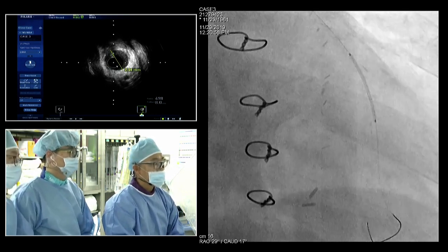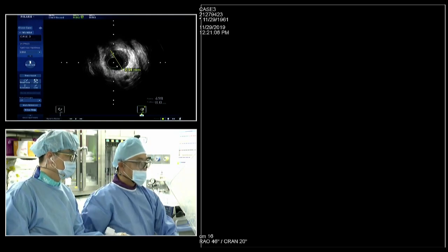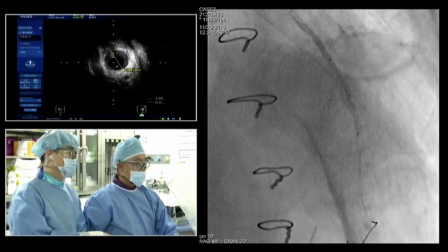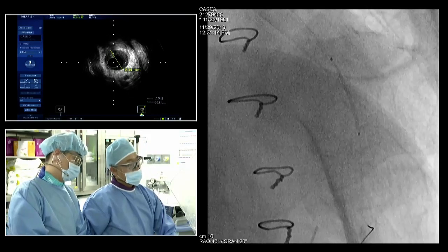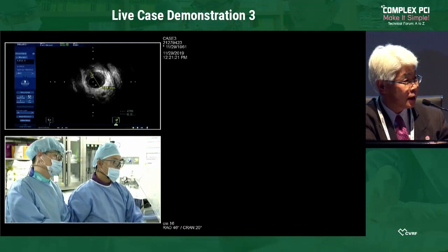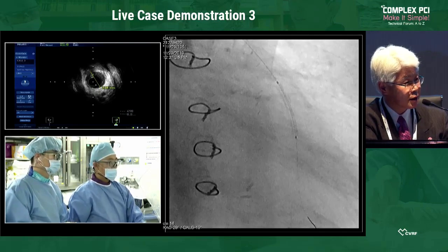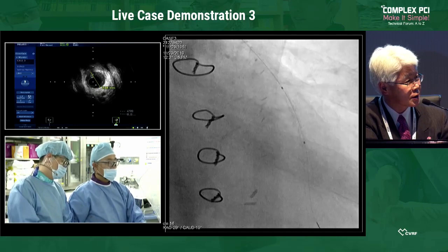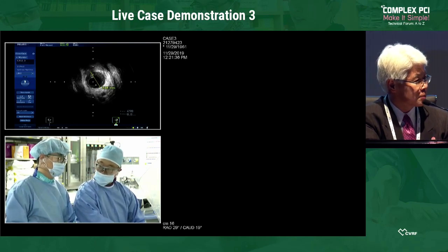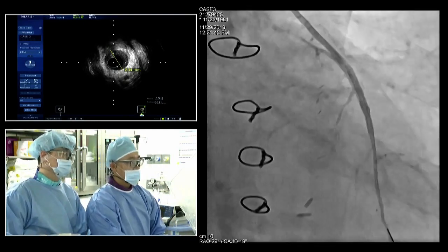Akasaka-sensei worries about jailing the proximal LAD. So we stent. In a case with a bypass graft, at the proximal site of the anastomosis, shear stress may decrease and atherosclerosis develops very rapidly, right? And if we put a stent here, there is much more disturbance in the flow proximal to the anastomosis. So my only concern is that condition. Anyway, he already put a stent.